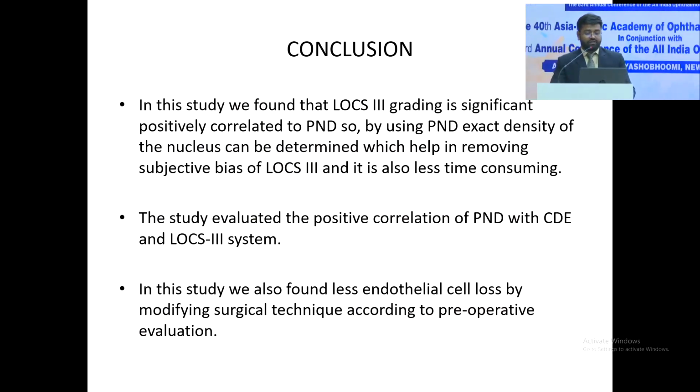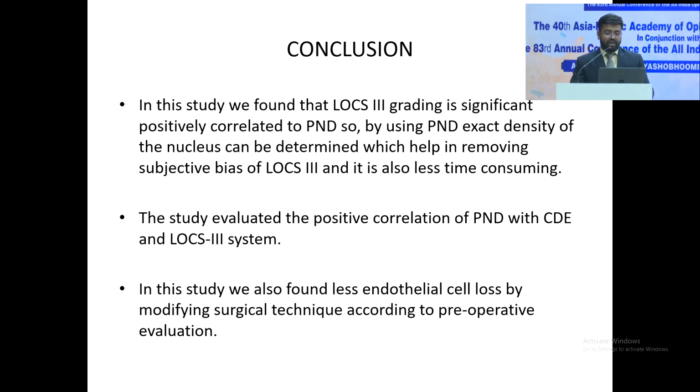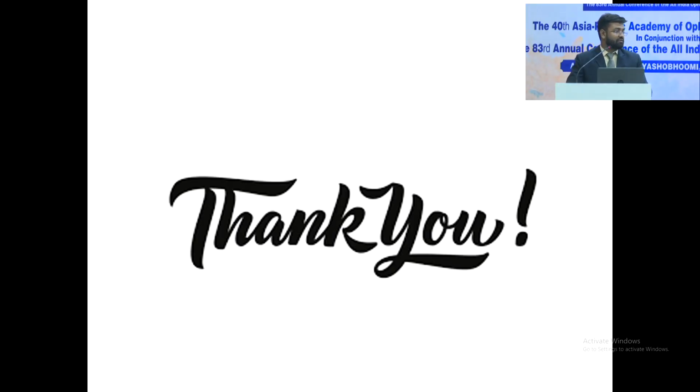So the conclusion in this study is we found that LOCS3 staging is significantly positively correlated with the Pentacam nuclear density. By the Pentacam nuclear density, the exact density of the nucleus can be determined, which helps in removing the subjective bias of the LOCS3, and it is less time consuming. The study evaluated the positive correlation between Pentacam nuclear density and CDE and the LOCS3 system. In this study, we have found less endothelial cell loss by the modification of surgical technique according to the preoperative evaluation.